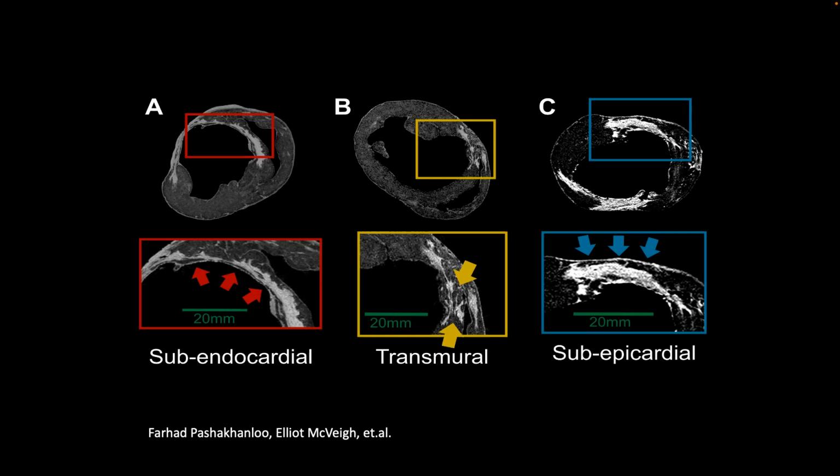There was a certain blurriness past which you could not get, right? Regardless of how well you thought you were measuring local motions and correcting for that, when you put all of the data together to get voxels on this size, it just came out blurry, right? And so we just gave up after a couple of years and said, look, the reason this is happening is because it's like a fundamental uncertainty principle of hearts. It doesn't come back to the same place.